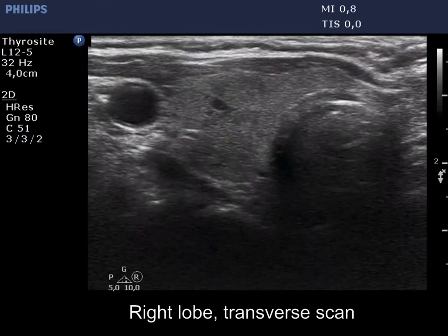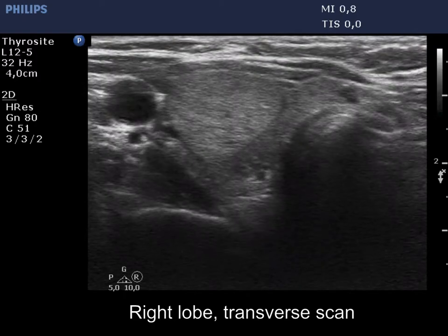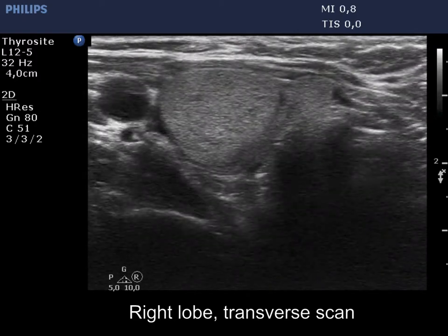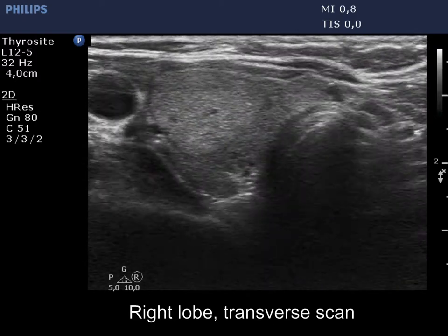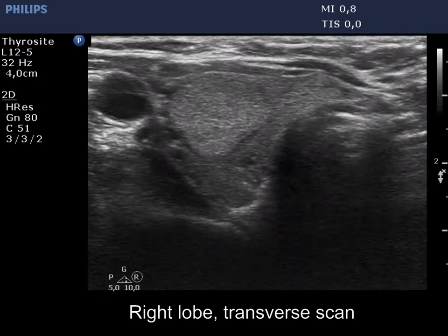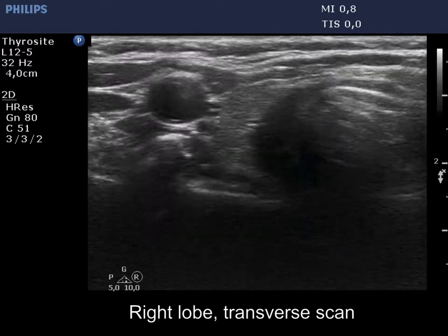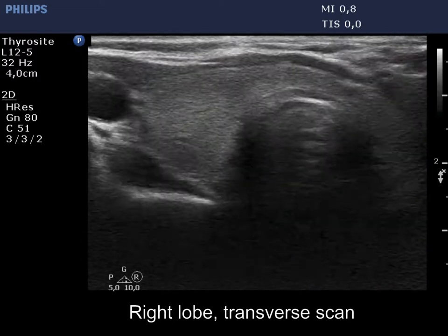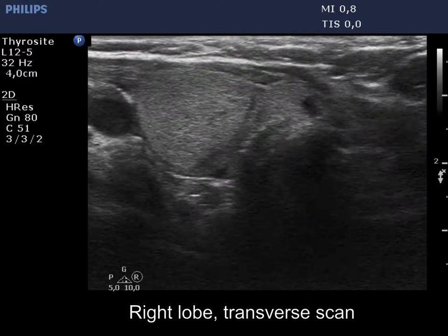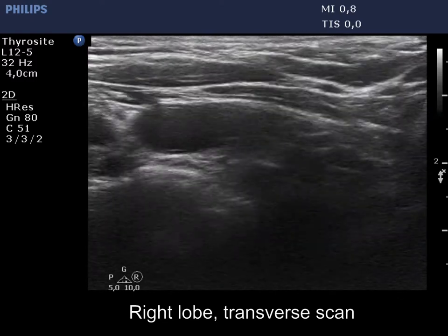The thyroid is ecnormal. There is an isoechoic or hyperechoic nodule in the right lobe. Note that the non-nodular part located dorsally to the nodule is hypoechoic. This is caused by the influence of the nodule on the propagation of the ultrasound wave.